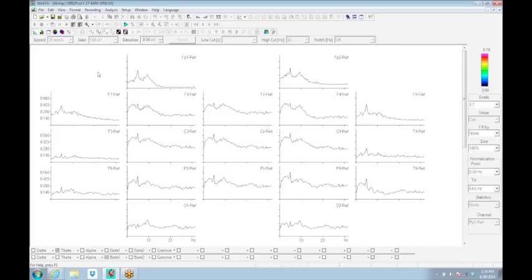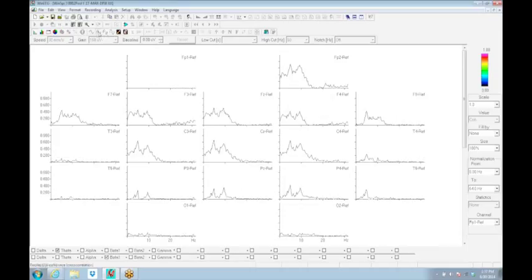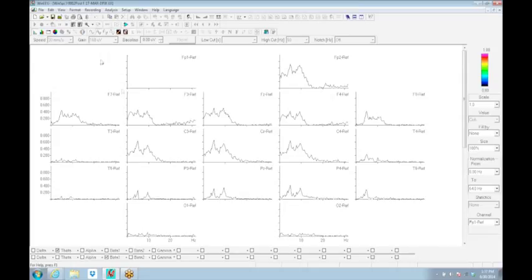Can you explain how, you know, you're saying coherence at FP1, that's where you had your crosshairs. What is it comparing it to? What is it the coherence to? This is the average coherence compared to all other sites. If you want to do pairwise coherences, that is back here. FP1 to itself is, in fact, an identity. So, it doesn't show. But you can select an electrode and how it's coherent to anything else ends up being seen here.